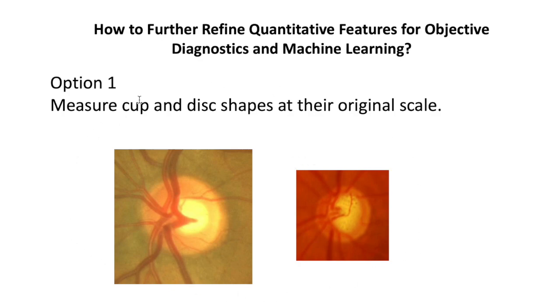However, this feature of measuring pure shape as we did is great news for the field because data imaged by different researchers at different places and different times will likely be taken at different scales. And thus, the ability to measure pure shape of an optic cup means that you can measure data taken by anybody, which allows you to have very large sample sizes despite differences in magnification.